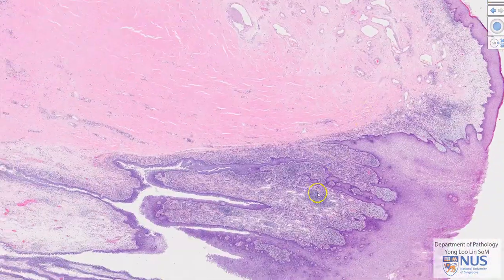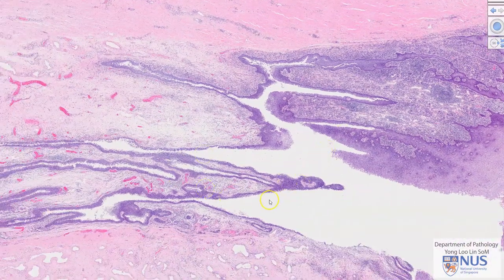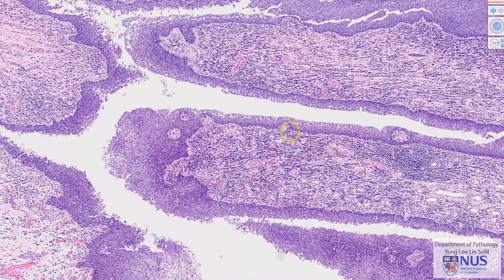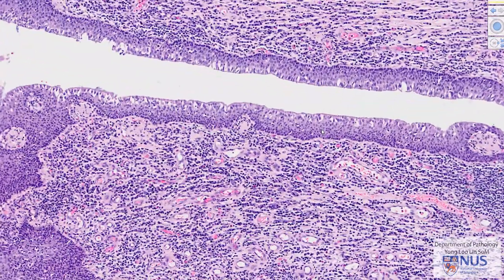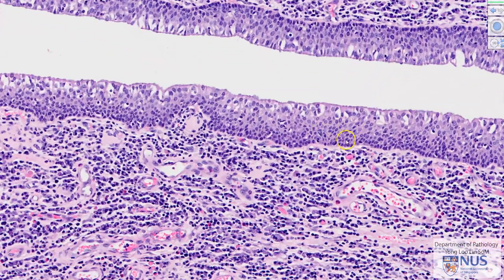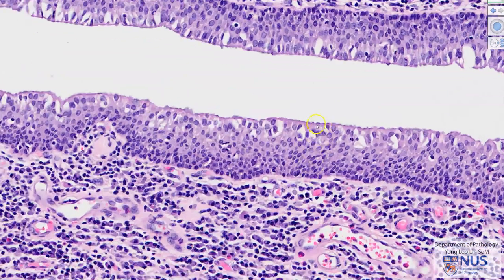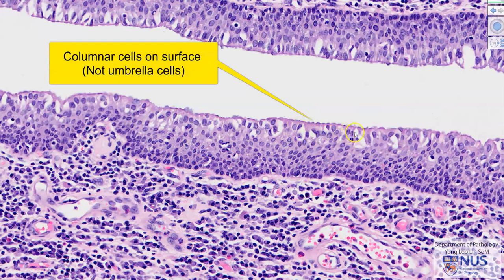Moving deeper into this central region, this is the penile urethra. I want to highlight that the epithelium of the penile urethra is slightly different from that of the urothelium in the more proximal urinary tract, such as in the bladder. This is more of a stratified columnar-type epithelium, and on the surface we see columnar cells instead of the usual umbrella cells seen in the more proximal urinary tract.